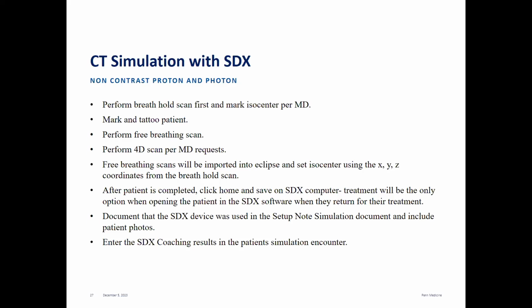You do want to document in the setup note that the SDX device was used, and you want to also include pictures of the patient in the patient position and with the SDX still connected to them, just in case there ever are any questions when they come back for treatment. And you want to enter your SDX coaching results. You're going to make sure you put that breath hold value in and the duration that they were able to hold their breath for.